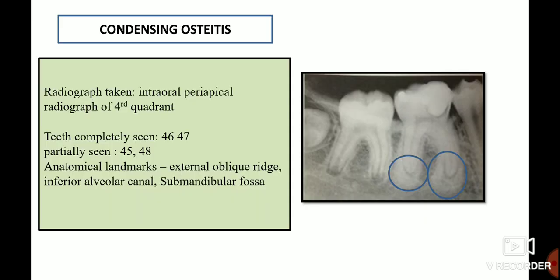Lastly, let's discuss condensing osteitis. The anatomical landmarks present are the inferior alveolar canal, external oblique ridge, and submandibular fossa. The tooth of interest is 46. In the root portion there is uniform widening of the PDL space surrounded by an ill-defined radiopacity. These features are suggestive of condensing osteitis.